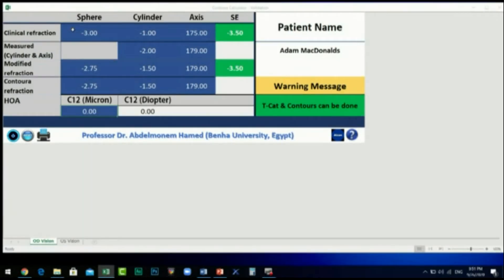In the third row, you will see that the calculator software has calculated the modified refraction according to the Alcon protocol. In the fourth column, the spherical equivalent of the clinical refraction is the same as the one for the modified refraction.